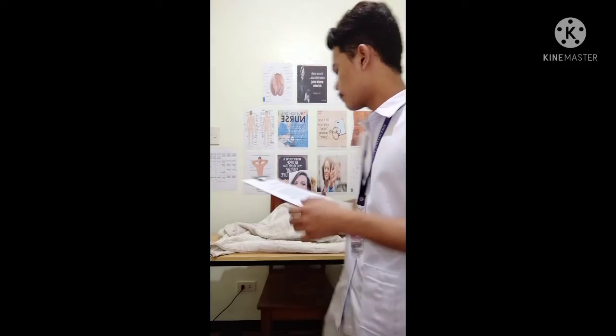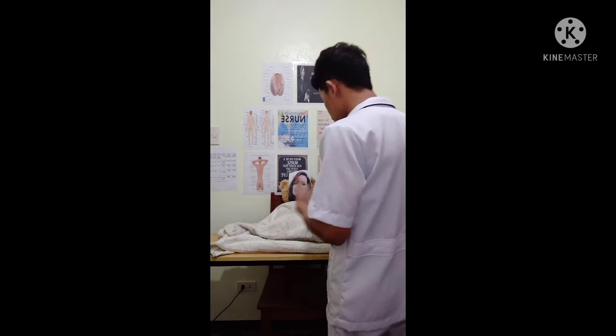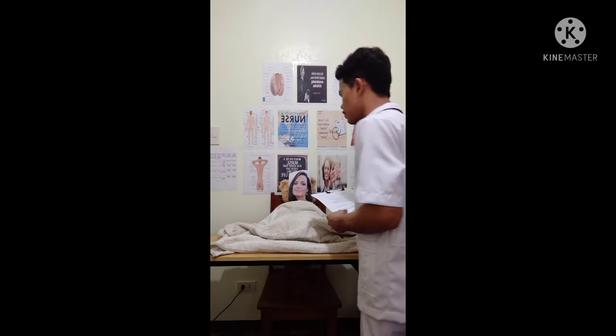So of course, after that we need to identify and explain the procedure to our patient. This is rendering the right care to the right patient, or to establish rapport. So good day, ma'am. I'm Heber Ilipiceros. I'm your attending nurse, or I'm your student nurse for today, and today we're going to perform a urinary catheterization.